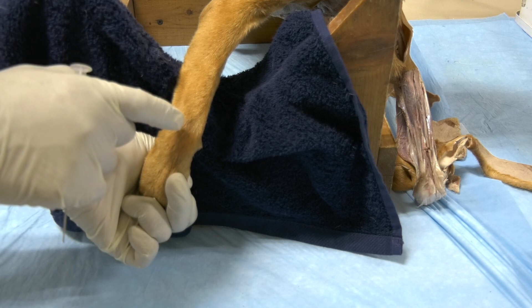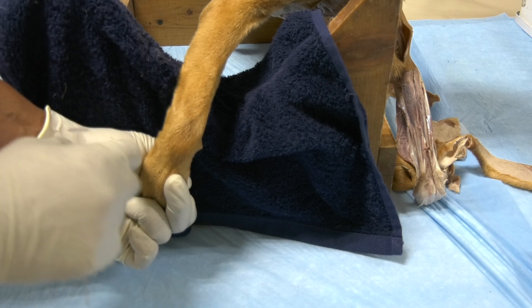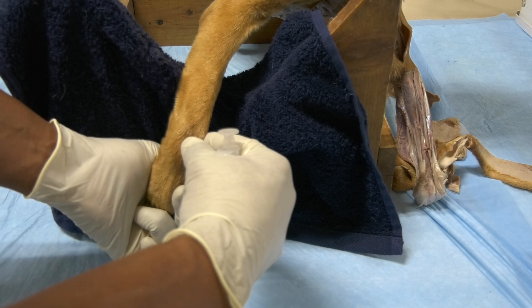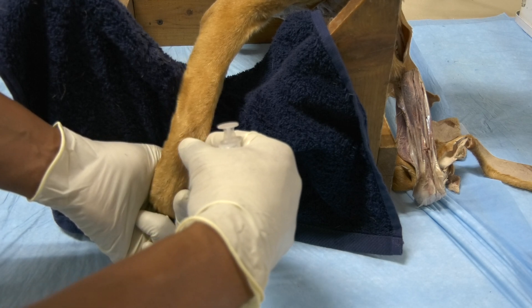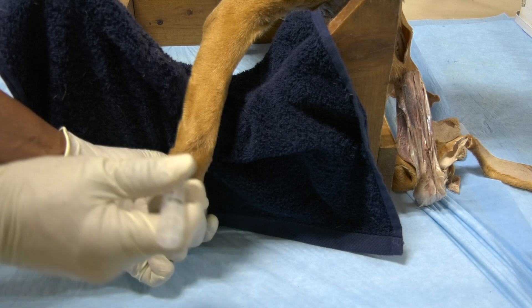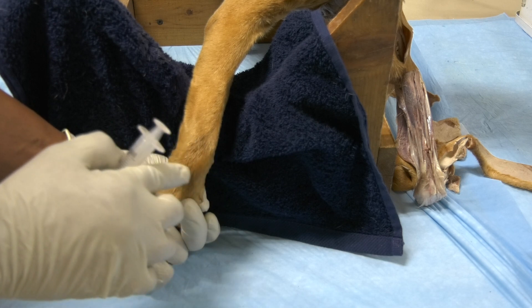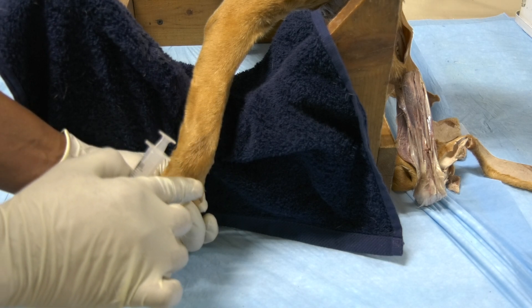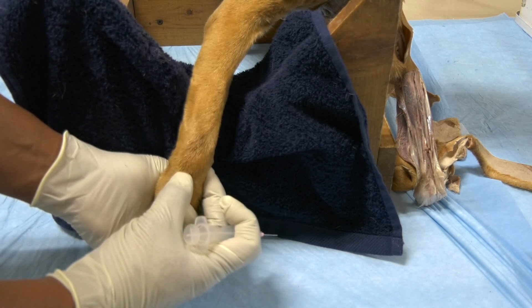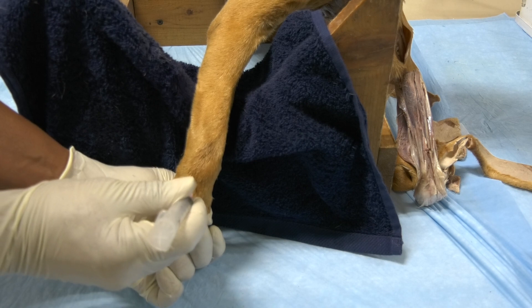You need to be careful about the cephalic vein because it also runs on the dorsal aspect of the carpus at this level. When you palpate, you move the tendon of the common digital extensor and the cephalic vein with your thumb medially. The soft area here is where you insert your needle. When you go to the midcarpal and the carpometacarpal, you do only one injection in the area between the second and the third carpal bone, and you insert it over here.